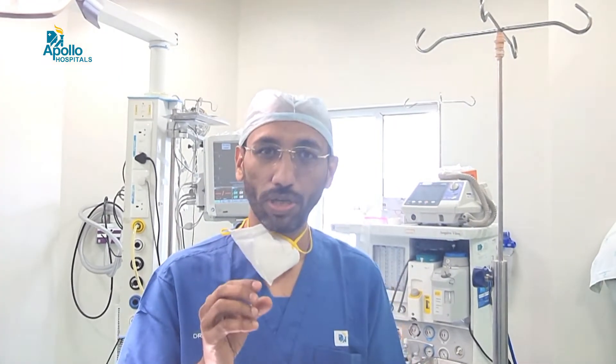Wrist arthroscopy is a keyhole procedure of the wrist. Arthroscopy refers to visualization of a joint through small cameras. Knee arthroscopy and shoulder arthroscopy are quite commonly performed, whereas the wrist, being a small joint, and other joints such as the thumb can also be examined.